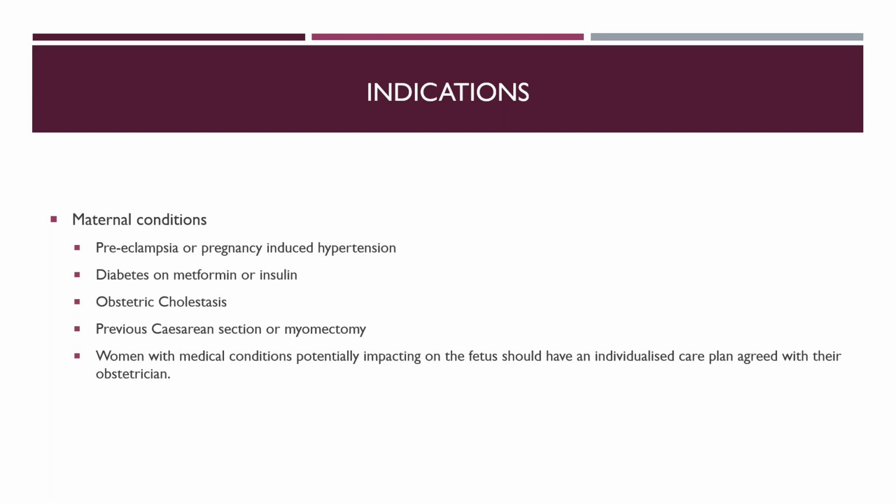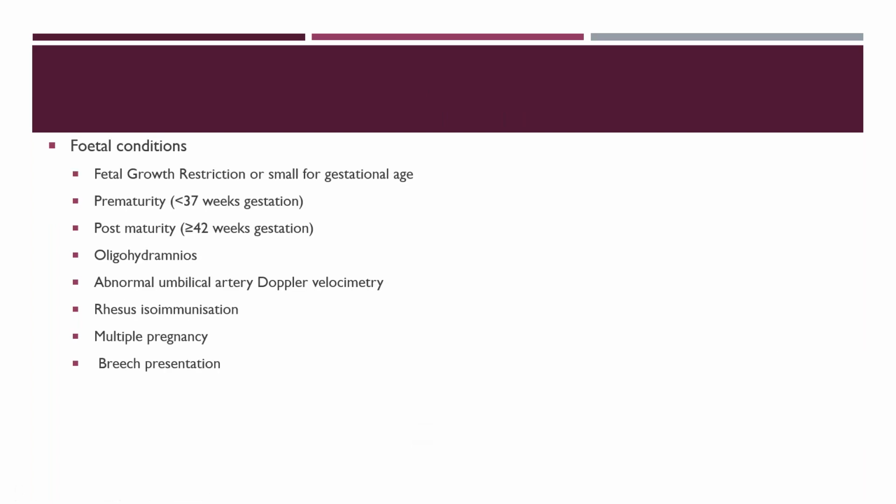For example, preeclampsia or pregnancy-induced hypertension, diabetes on metformin or insulin, obstetric cholestasis, previous cesarean sections or myomectomy. Women with a medical condition potentially impacting the fetus should have an individualized care plan agreed with their obstetrician. So these are the situations where you need continuous monitoring.